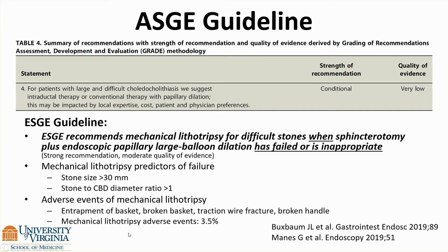So with respect to the ASGE guideline, it does make room for using intraductal or conventional therapy with papillary balloon dilation for these large stones. ESGE also recommends mechanical lithotripsy for difficult stones when sphincterotomy and endoscopic papillary large balloon dilation has failed or is not appropriate.